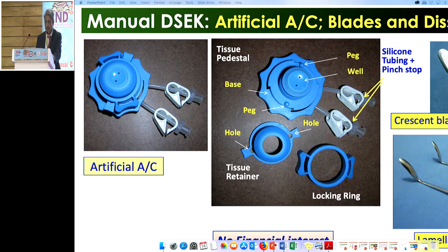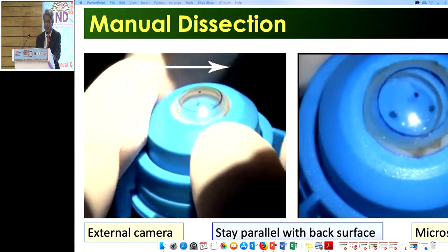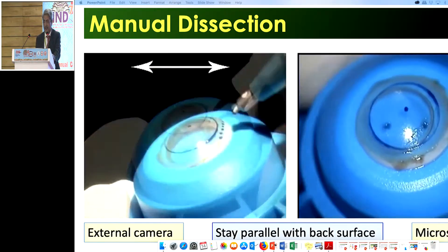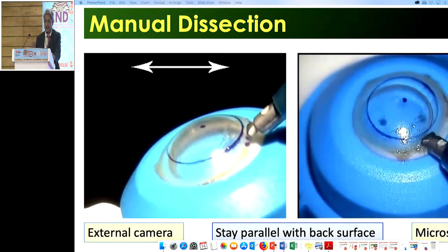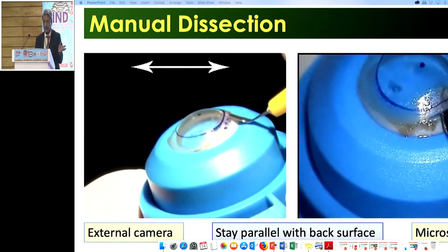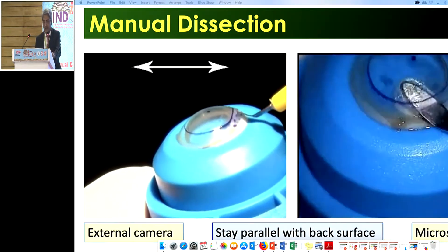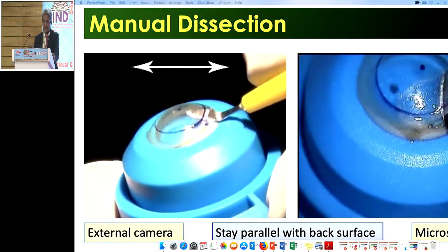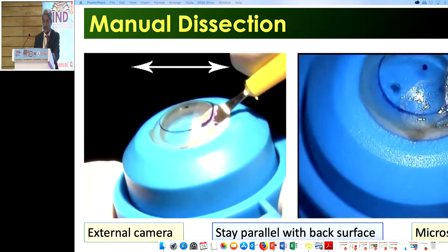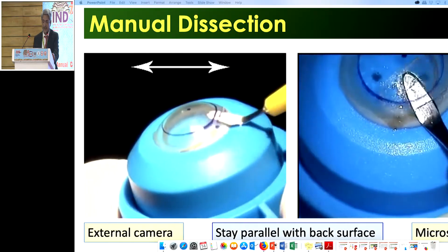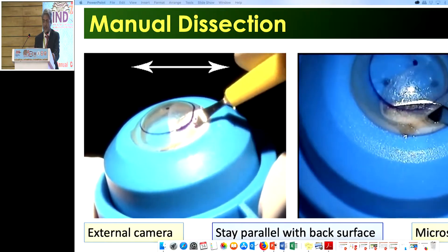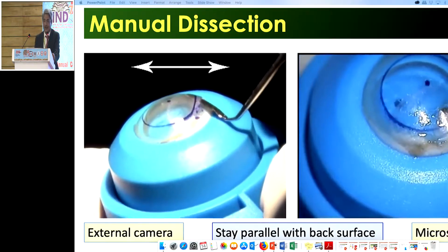This is a very beautiful instrument — no financial interest. I have been using it for the last 13 years. It is a very handy instrument; you just take it in your hand. The dissection requires a little practice. One view is through the external camera and one through the microscope. We use a simple lamellar dissector, the same one used in normal SICS. If anybody can do SICS, they can go a little further and do manual dissection.